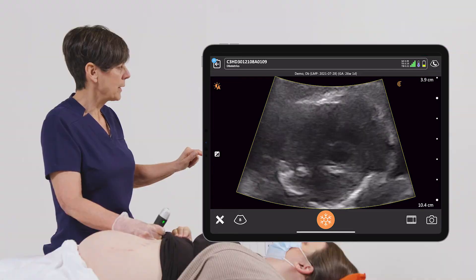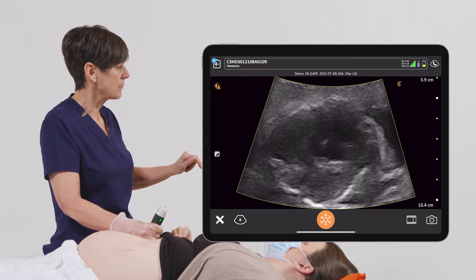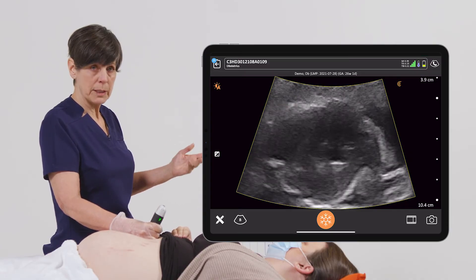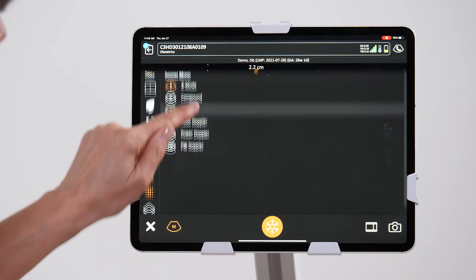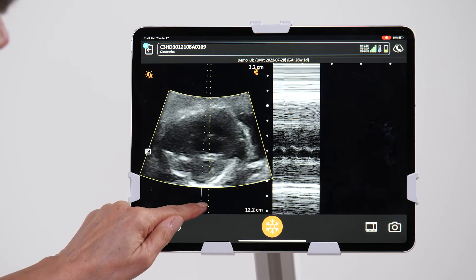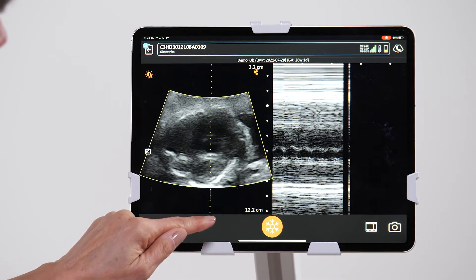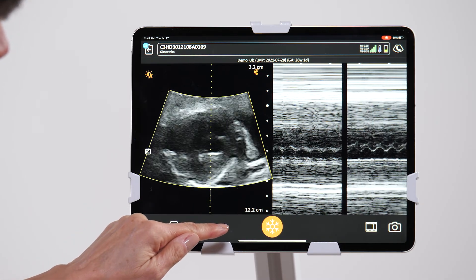Double tapping gives me a nice high-definition image of the baby's heart. Here we can actually see the valves opening and closing. So again, we can do the same sequence again — enter into M mode and place our line over the valve in this case.